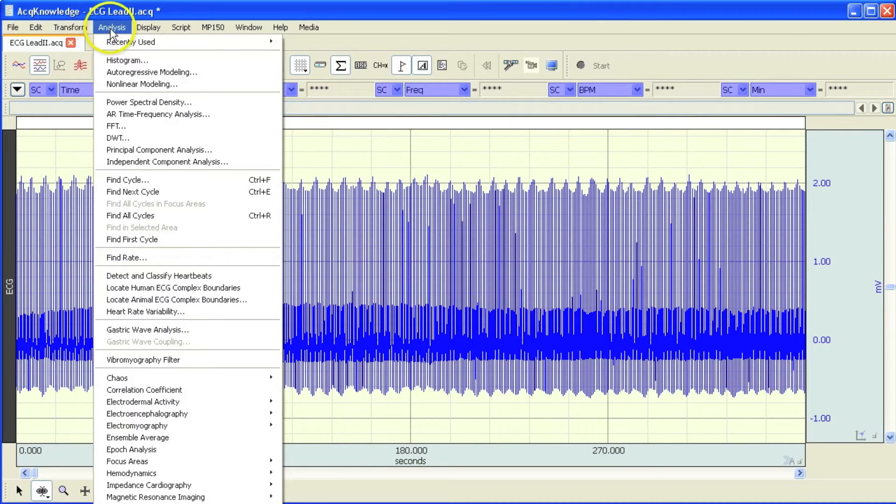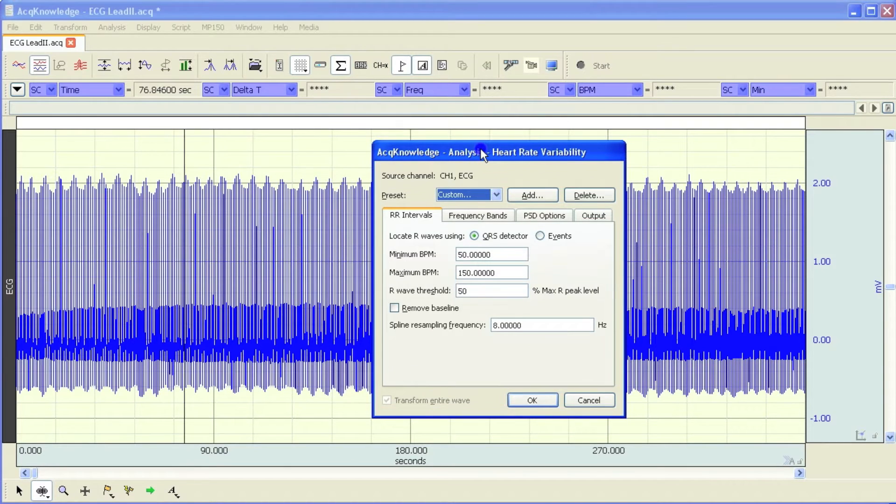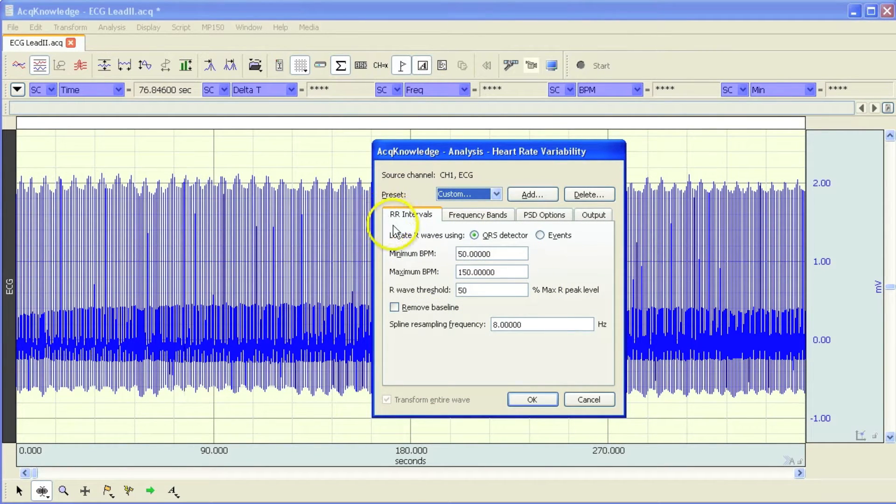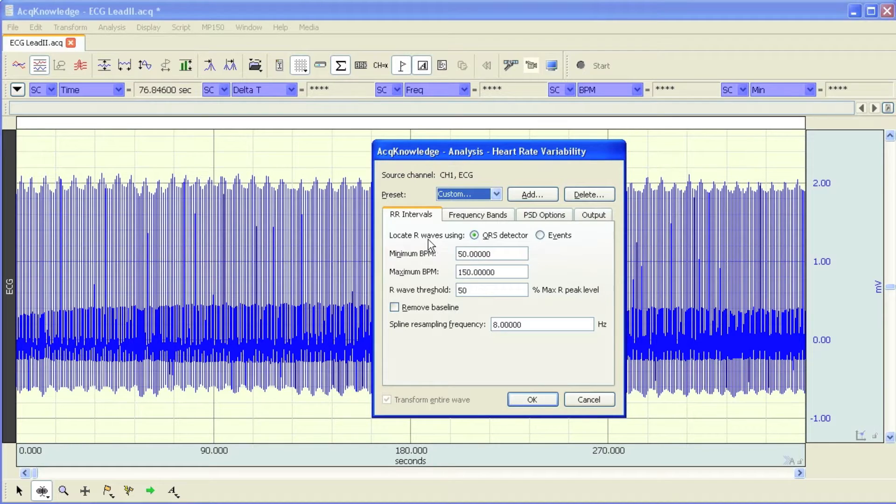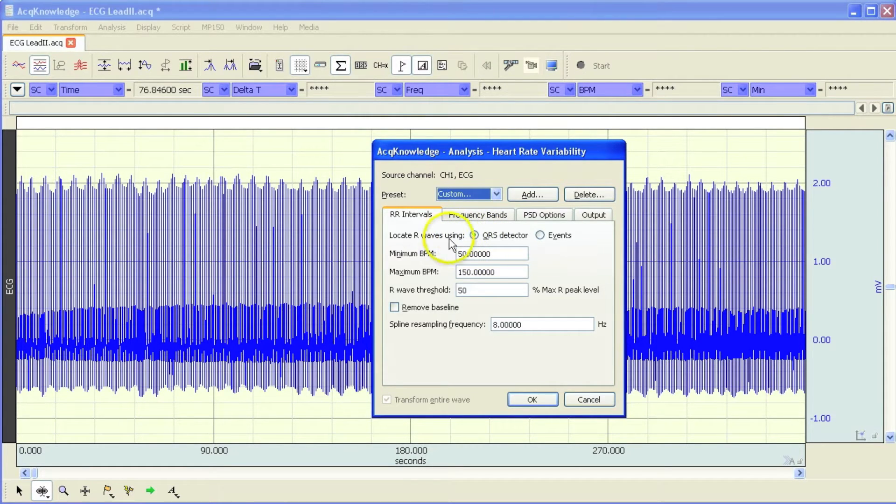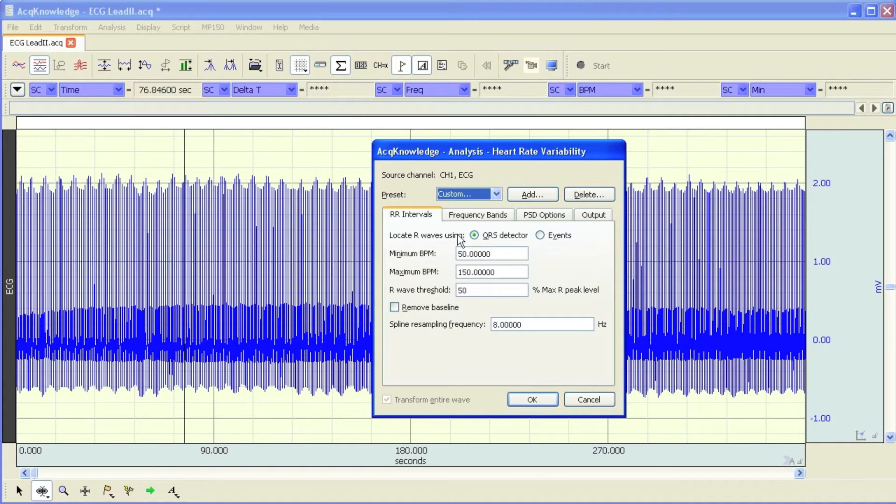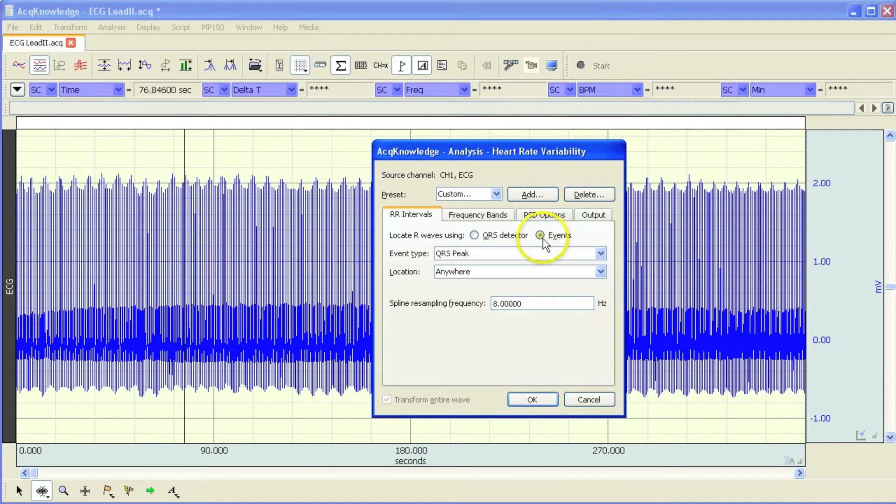So when we go into the HRV dialog box, you can see that the first option allows you to determine the method in which you are going to create your tachogram. The default being the QRS detector. The QRS detector is using a modified Pan Tompkins QRS detector, but there is also an option to locate events within the ECG waveform, and I'll get back to this option in a moment.